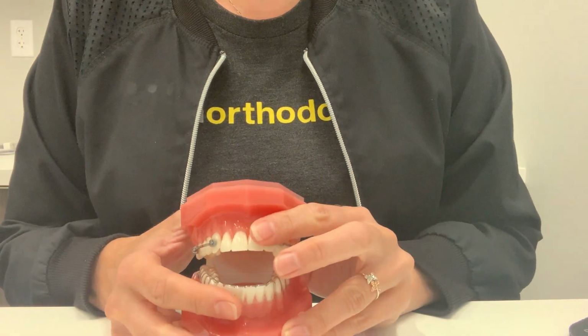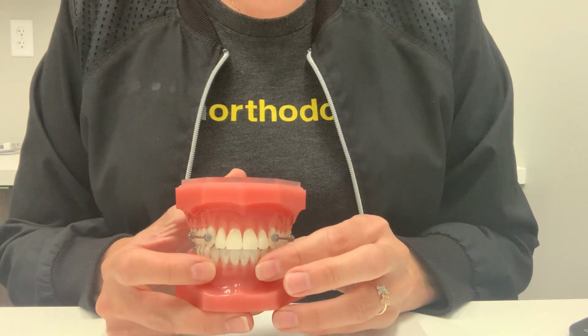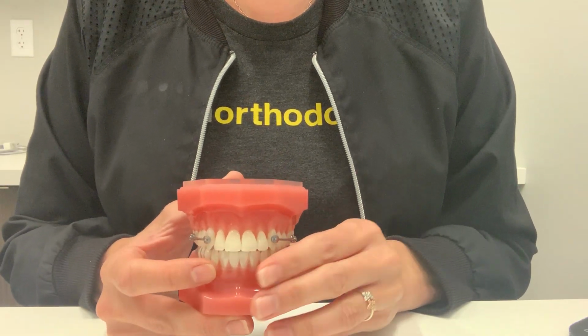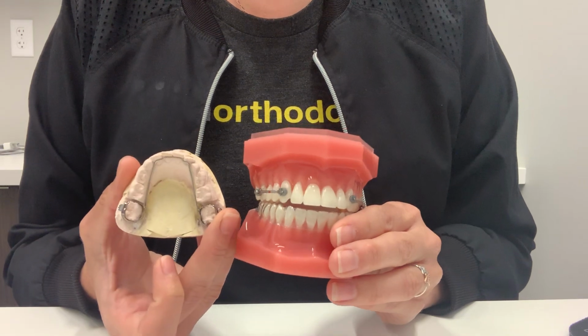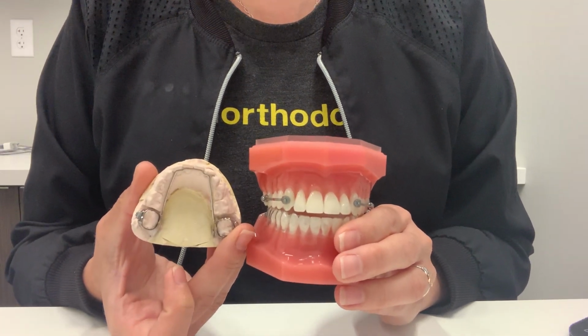The most important thing to remember with the motion appliance is always wear the rubber bands and the removable retainer together. You never want to wear the rubber bands without the retainer. Same thing with the lingual arch appliance. If for some reason it ever comes out, do not wear the rubber bands until you can get in to see us and we can cement the appliance back in.